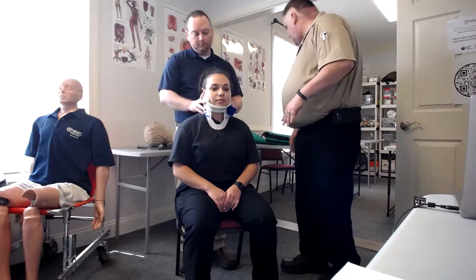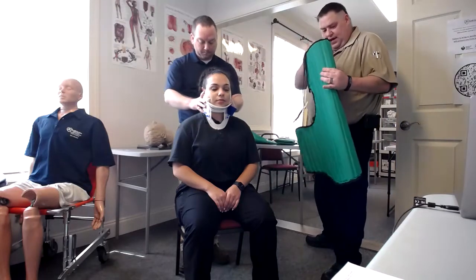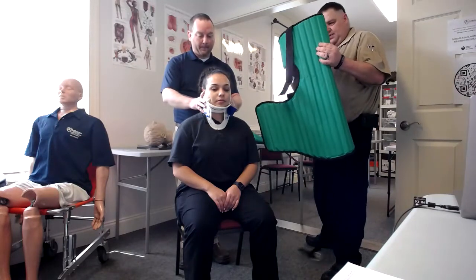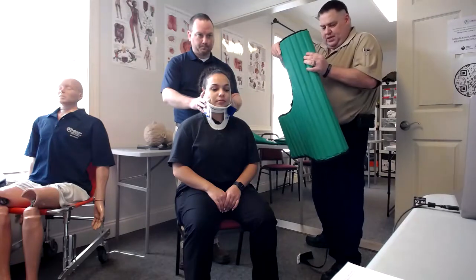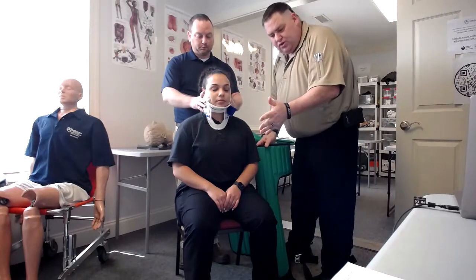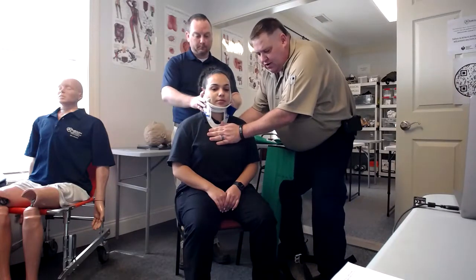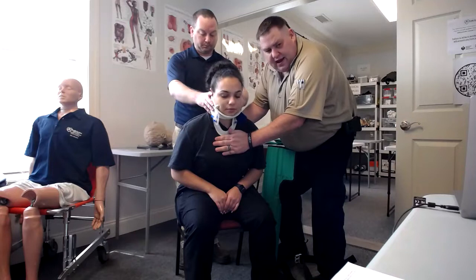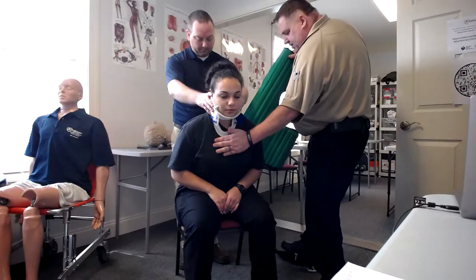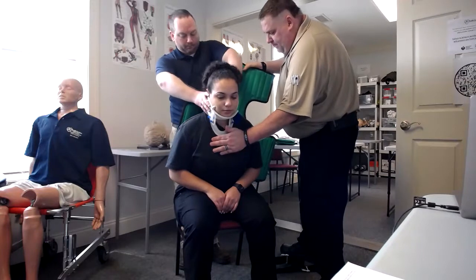For the Kendrick Extrication Device, make sure it is set up so that you can easily get the straps and pull them down — those would be these long straps right here. We're going to maintain C-spine control and control the patient during this whole process. You're going to place your hands on her chest, place a hand on the back, and lean the patient forward. Without removing your hand on her chest, you're going to take your Kendrick Extrication Device and slide it in behind the patient so that the base of it goes down.